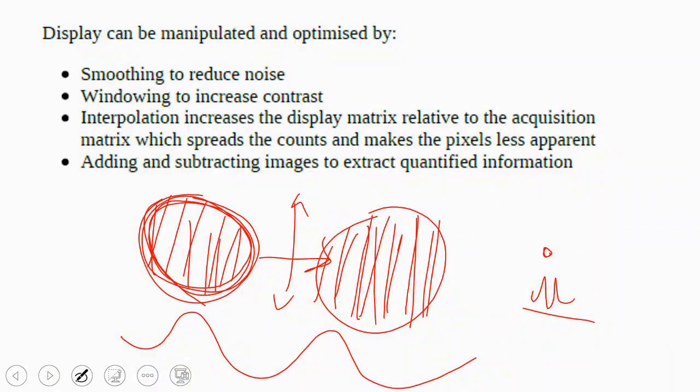The amplitude is a different story, but I'm talking about frequency. What does frequency mean? Can I see this illuminated object in relation to the background or not? Will I be able to see it correctly? Why? Because it is taking a signal from the radioactive material. As long as you can see the object in relation to the background around it, what does that mean? It means that your frequency is low.